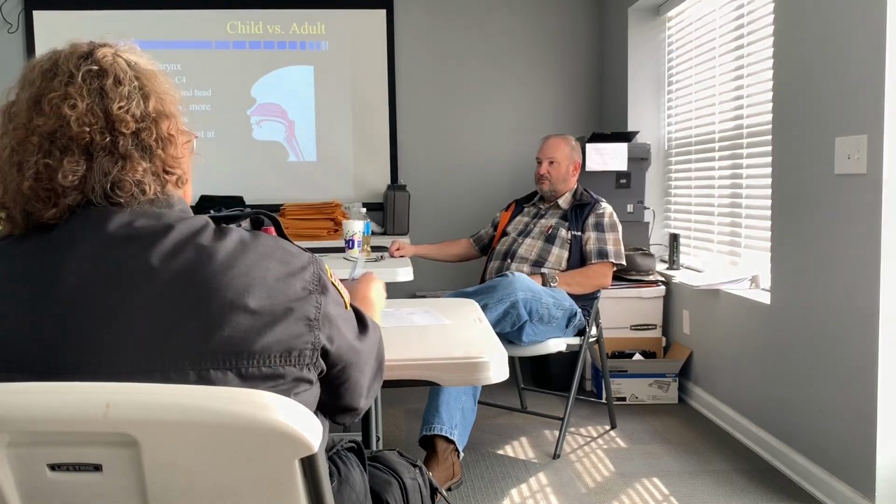So if you're going to use a 5, use a 4.5 cuffed, and you can pop it in there and then seal that. Remember, you don't get true positive pressure ventilation unless you have a sealed system, right? If you've got a leak, you're not going to get positive pressure ventilation. So if we can use a cuffed tube in a pediatric patient, that'll work fine too.